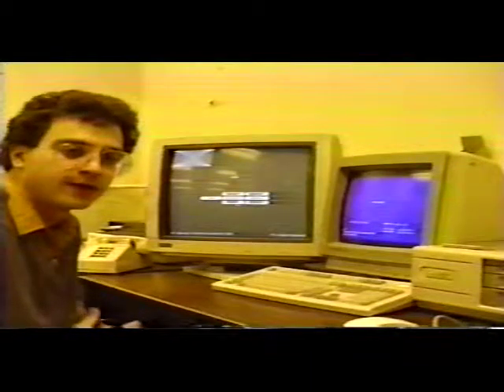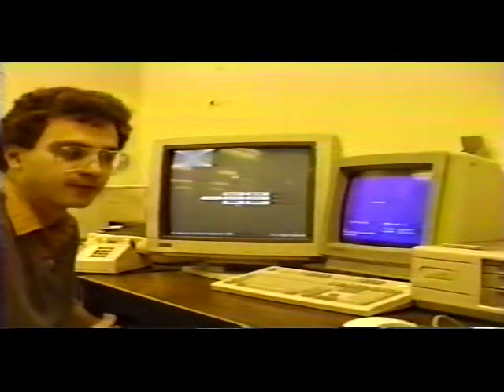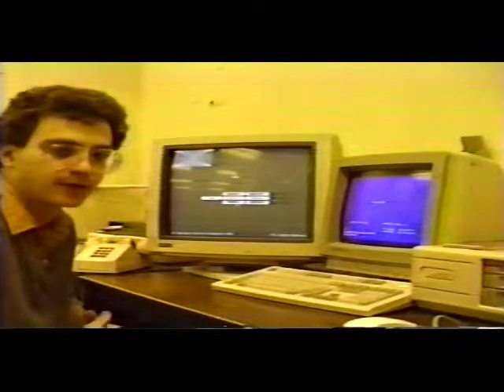I want to thank you very much for the time you've given me, and this is the IRIS Medical Card Application Program.